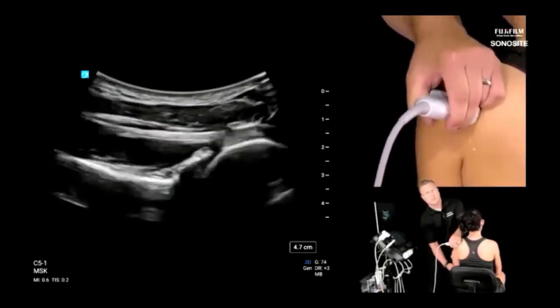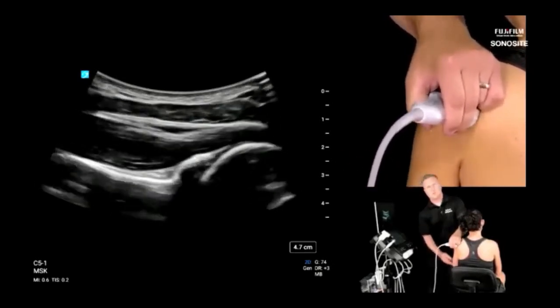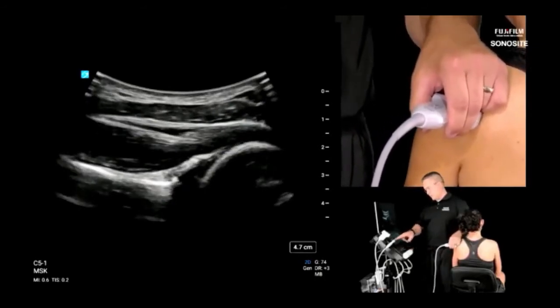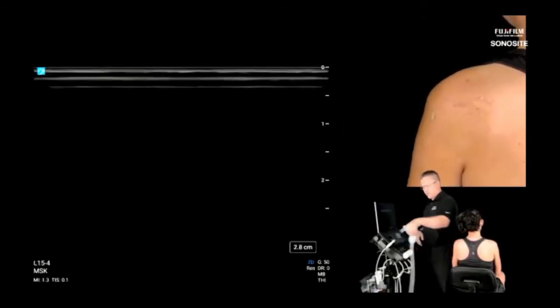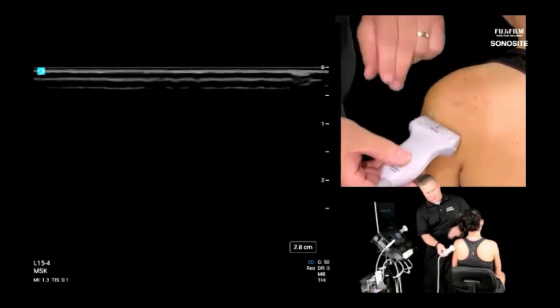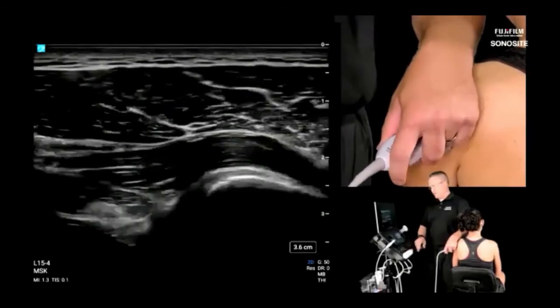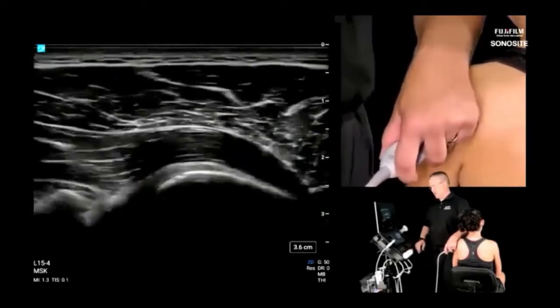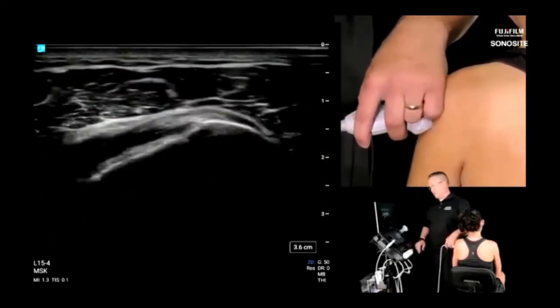Okay, 5 minutes, good. In short axis view of the teres minor, can you show the upper tendon, what it looks like in the longitudinal view? You bet. We'll switch back to the linear. Very easy on the PX. And I'm just going to jump right down, angle up, because you should have good scanning habits after doing this a few times of just being able to drop on these. But here we are in long axis, and let's go to the most distal insertion first, okay?